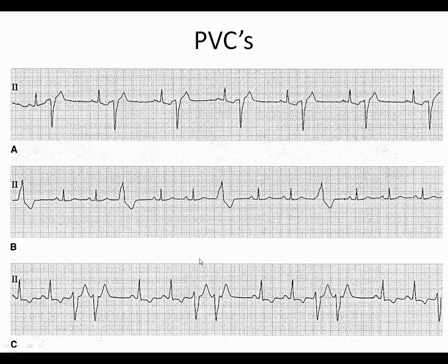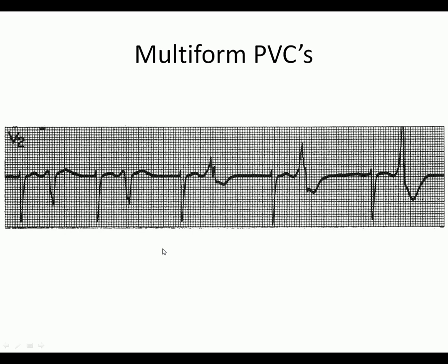Here's what I was talking about with multiform PVCs. We first find our normal QRSs — here's one, here's one, here's one. These are all PVCs. Notice how they all look different — that's not good, because we have multiple areas of the heart spontaneously depolarizing. That usually means there is ischemia in multiple parts of the heart. Multiple PVCs with different morphologies indicate multiple areas of ischemia, which is quite serious.